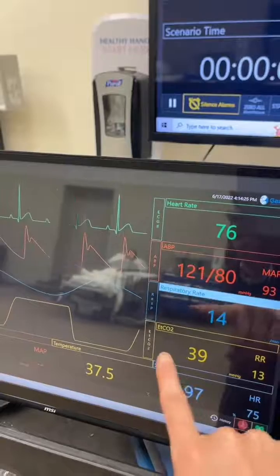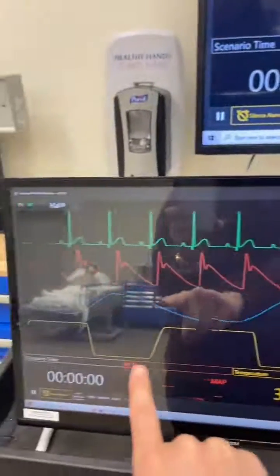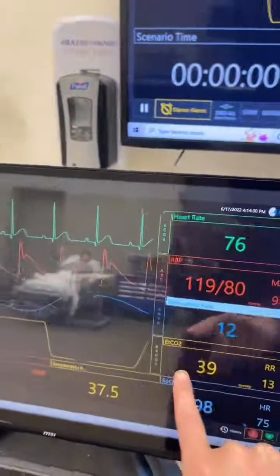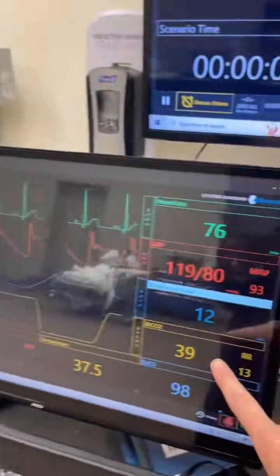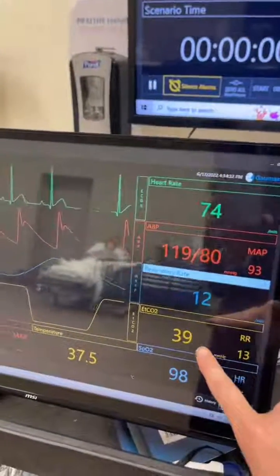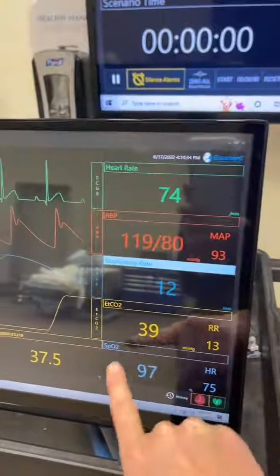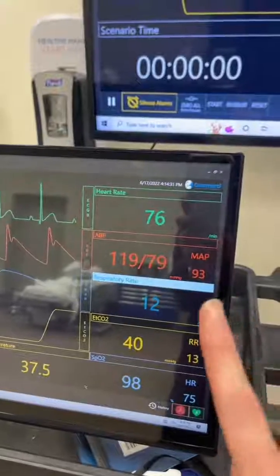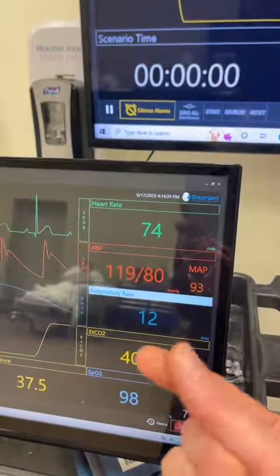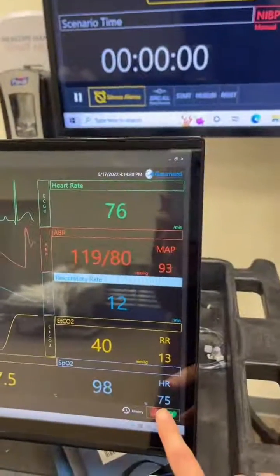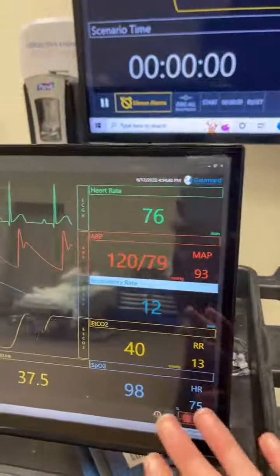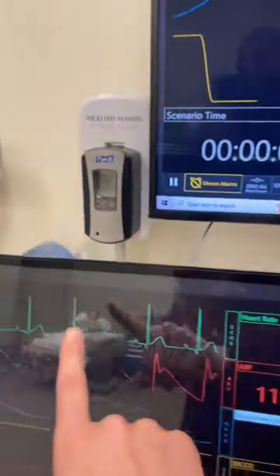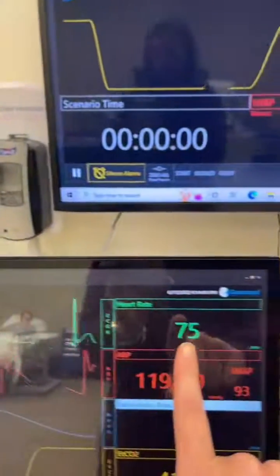This has end-tidal CO2 — not every patient is going to have that monitoring, but if they did, that's what it would look like, typically in yellow. Then we have our SpO2, our oxygen saturation, typically via pulse ox on their finger. You also have heart rate down here, but if you need a heart rate, always go off of the telemetry.